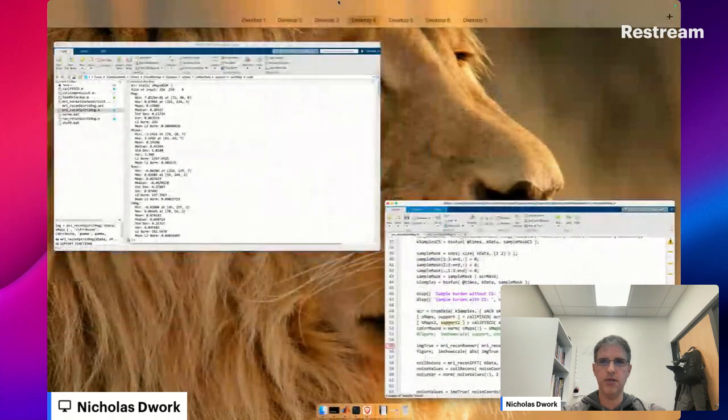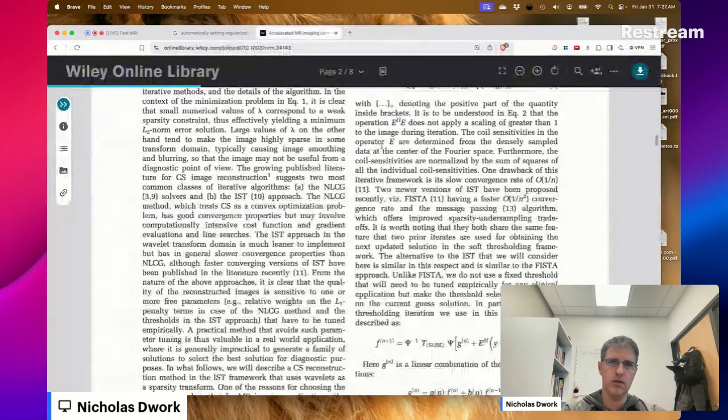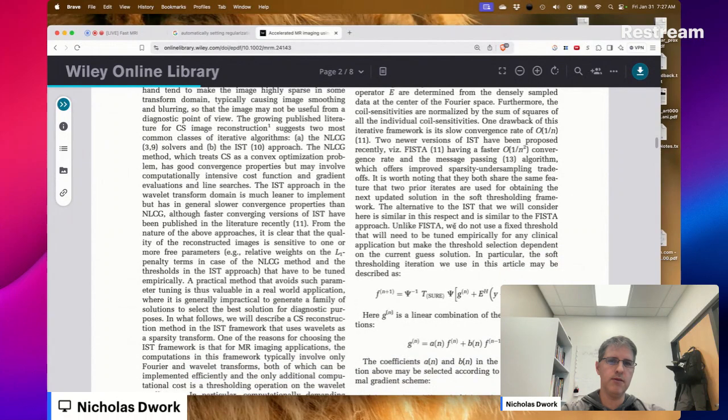So then that wasn't the issue, so we're going back to the paper. Unlike FISTA, we do not use a fixed threshold that will need to be tuned empirically for any clinical application, but make the threshold selection dependent on the current guess solution.